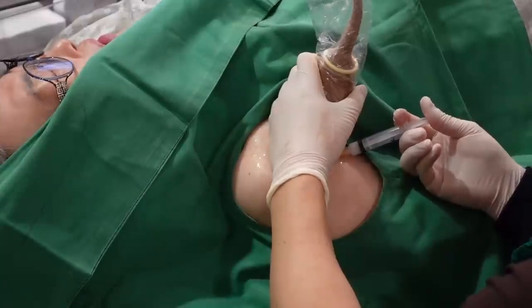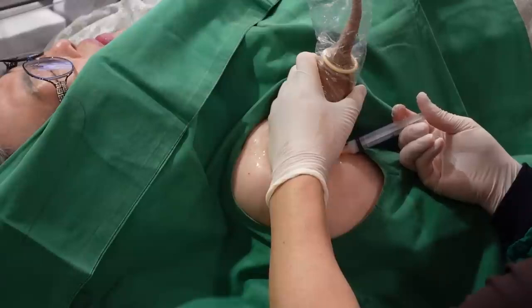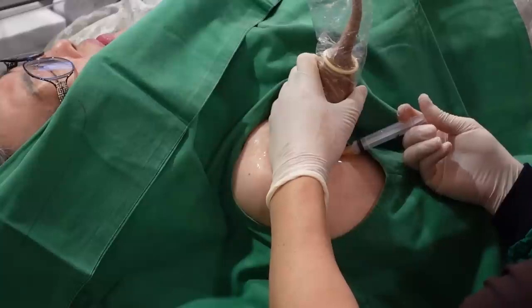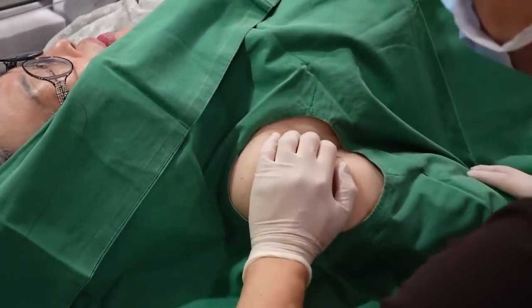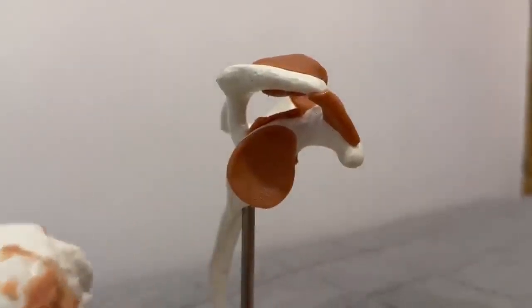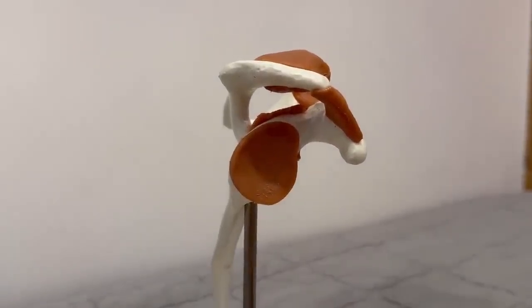The first modification target is the 12 o'clock position of the articular surface of the scapular bone. The second target is similar to adhesive capsulitis. But sometimes, the needle should be deviated to the more scapular attachment site instead of the humeral attachment side of the inferior capsule. Let me explain the model. To understand this better, I will remove the humeral head. It is an anterolateral view of the glenohumeral joint.